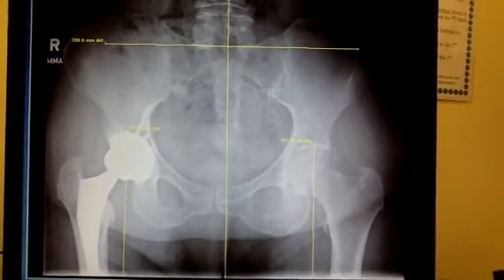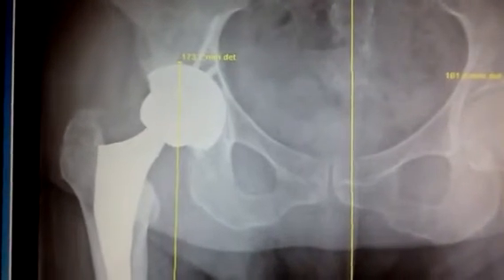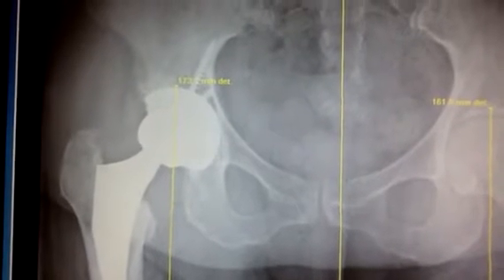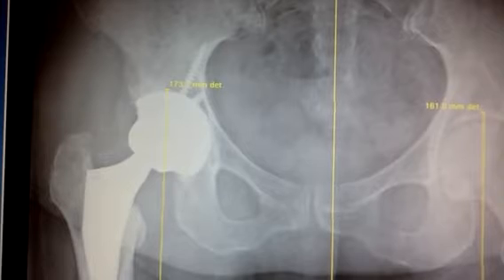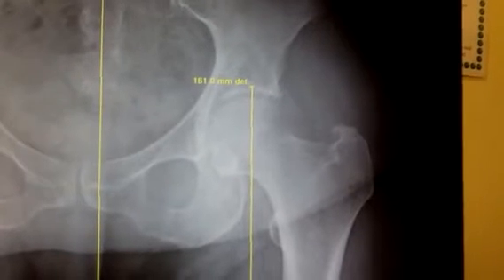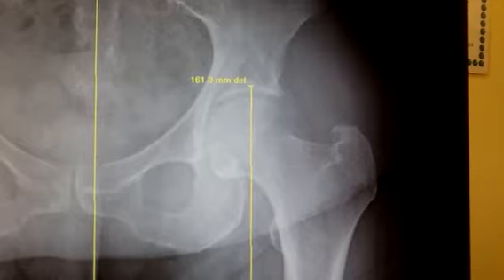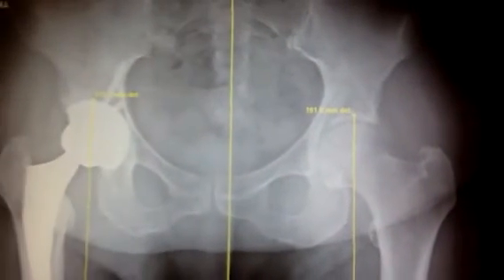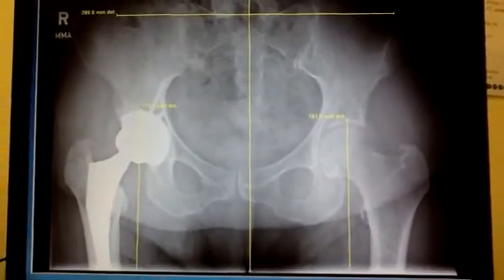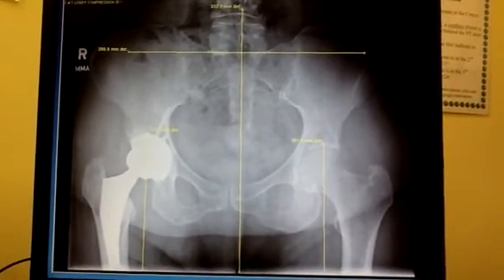The hip height is actually higher. We focus on the top of the prosthesis after the hip replacement on the right — I've got 173 millimeters on that side compared to an approximate same weight-bearing surface of 161. So that would show about a 12 millimeter, or a half inch, longer right leg.